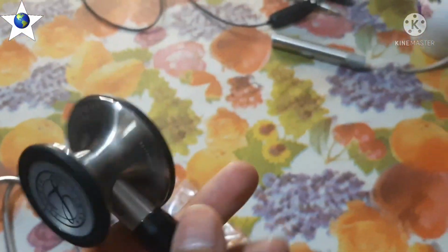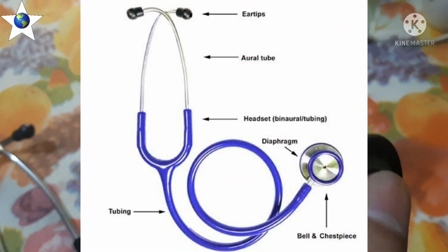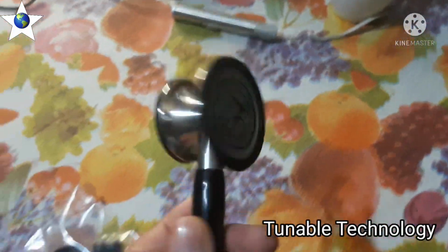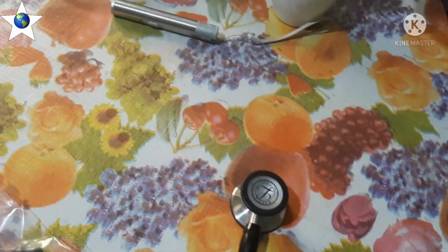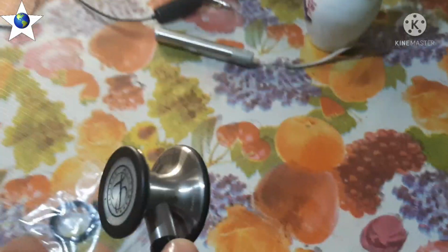Earlier the concept was that if you use a bell you hear low frequency, and if you use the diaphragm you get high frequency sound. But the modern technology is tunable technology, and the concept has changed. So the traditional bell is not required, but still you have an option to convert it into a bell. This is up to you, but this is the pediatric diaphragm, which is very helpful, and this is the adult side. All right.